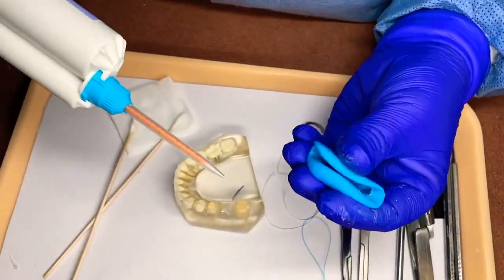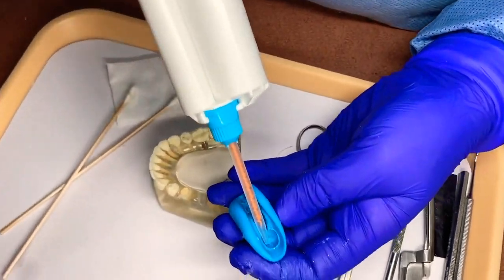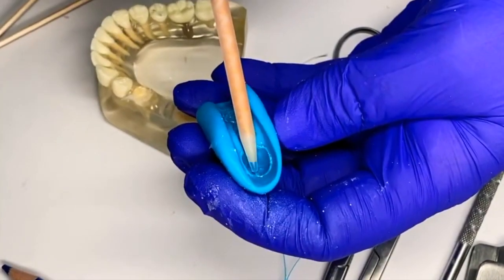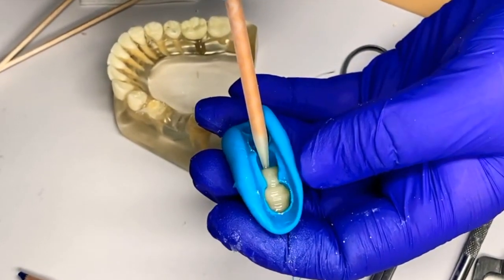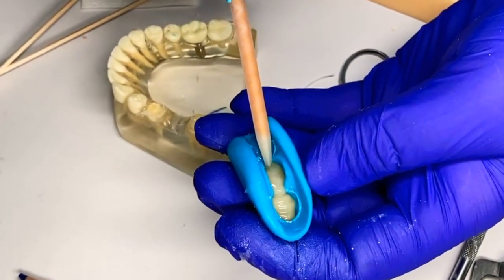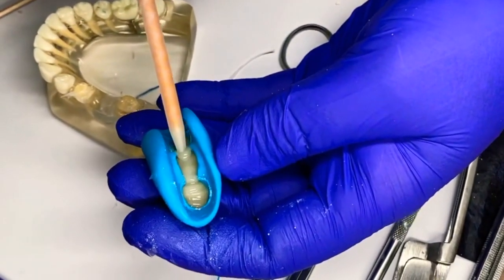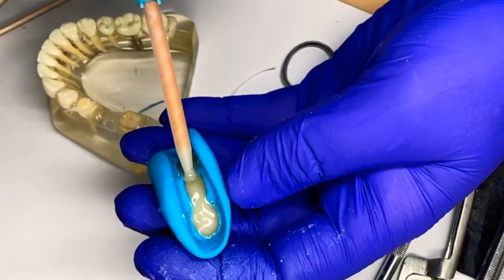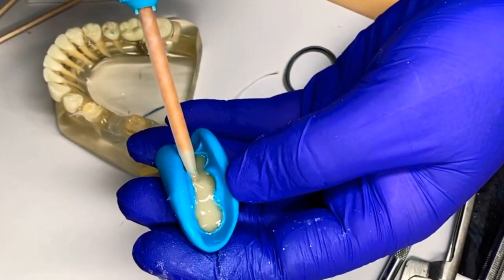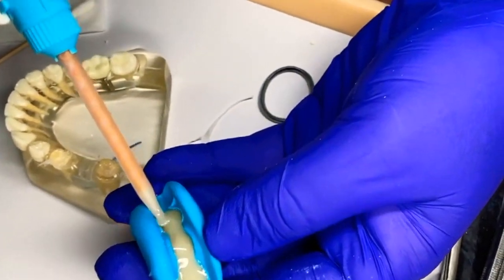I'm just going to gently hold this — I'm not going to squeeze it, I'm just going to hold it. Fill it from the distal of 18 all the way to the front, holding it down on the bottom of the teeth so we don't get any voids or air bubbles.